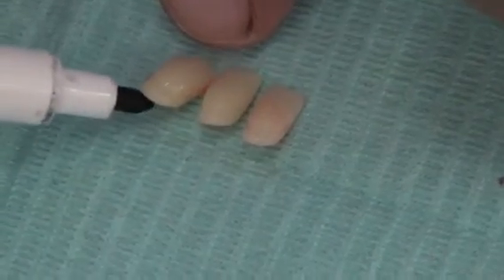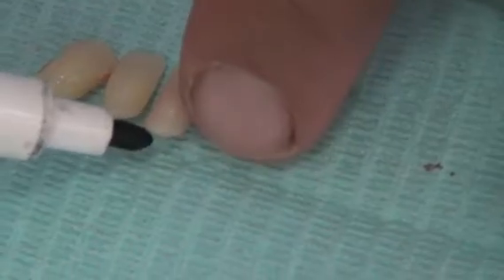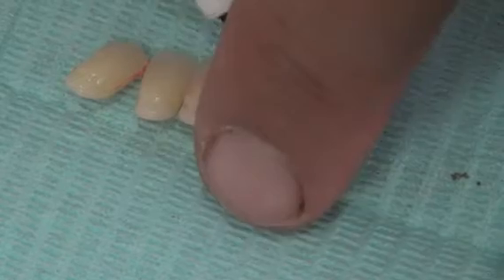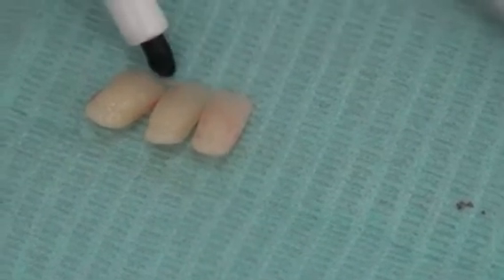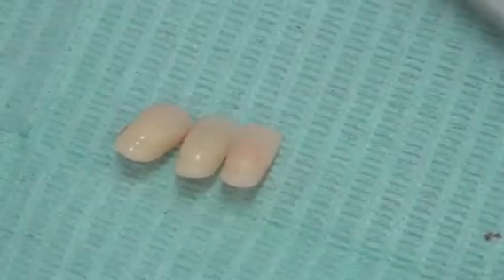So this will not apply unless I put the canine in this angulation. So this is straight, this is now straight, and with the distal surface of the canine, they are all on one line incisally. Okay?